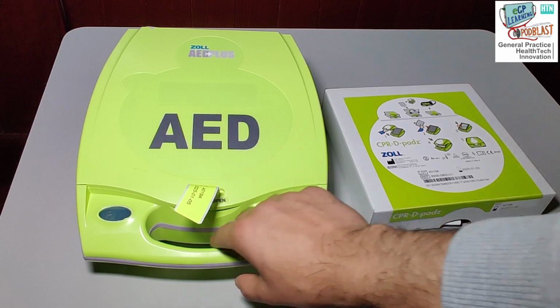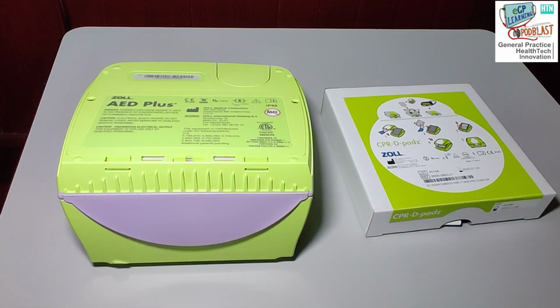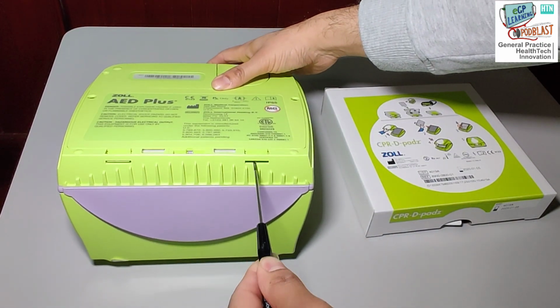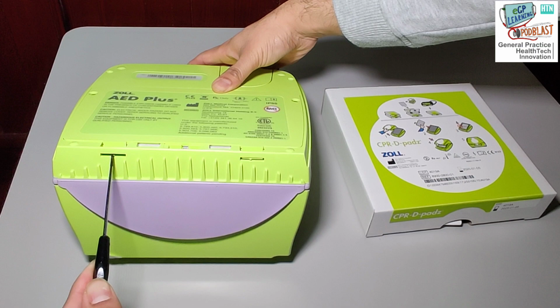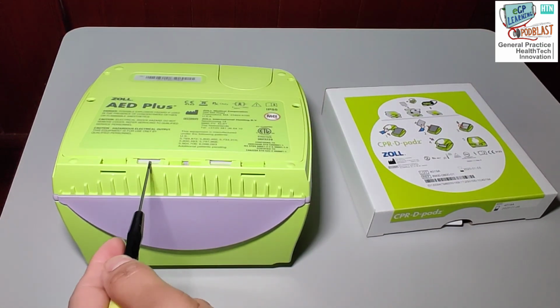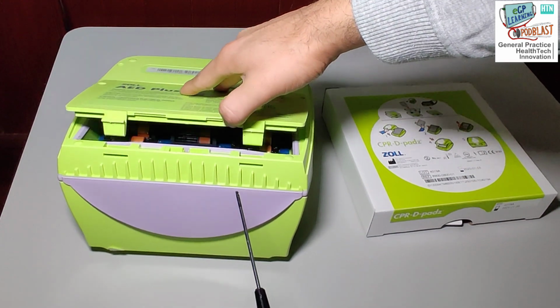To do so, flip the machine over, and this is the battery pack. In order to install the batteries, simply you have to open up these levers here, so that's why you need the screwdriver. So just insert slowly, push and up, and similarly on this side, push and up. Once you've raised the tabs, you can then insert the screwdriver underneath just here and simply lift. And that raises the battery pack.